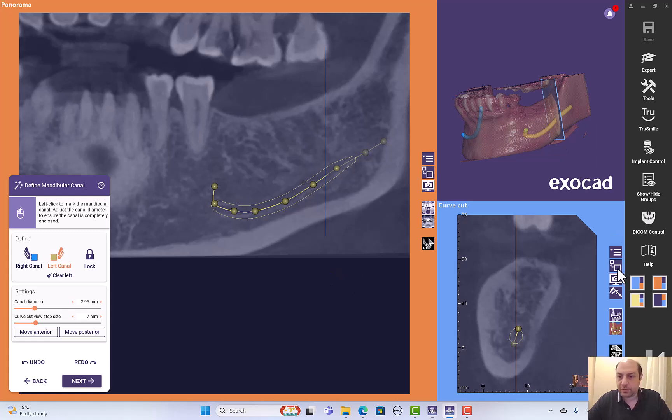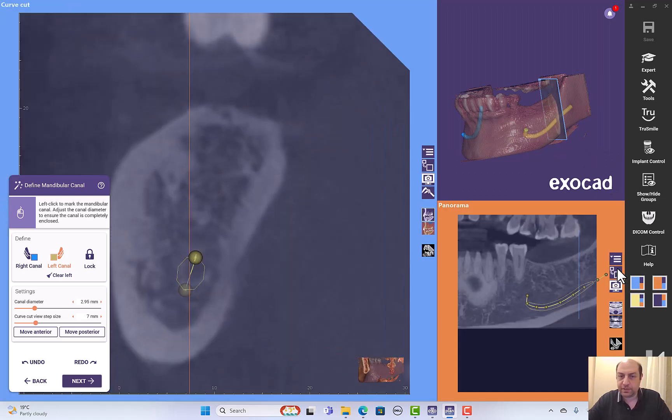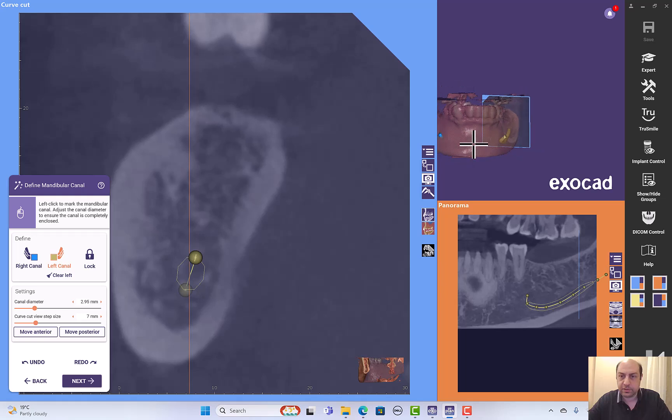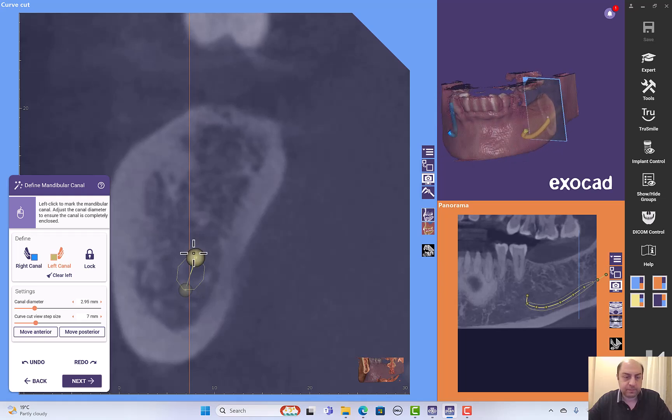With that said, we have our nerve traced right and left. You can see it on the 3D and we can go to the next step and click next.